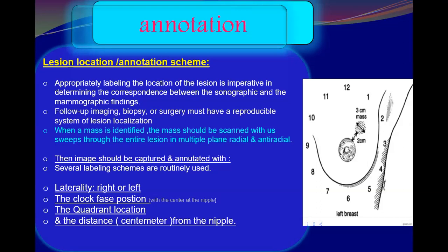We have to describe at what o'clock. Sometimes we can mention even the quadrant. If we mention the clock, that means it's understandable. Sometimes they describe by quadrant locations. And sometimes they also use the distance from the nipple, which is more constant.